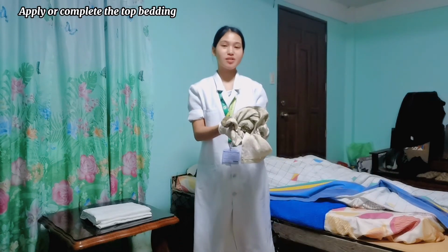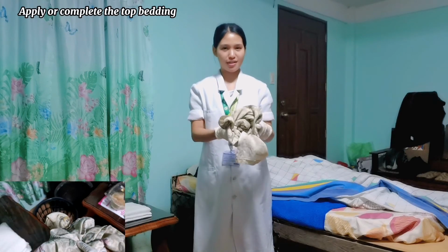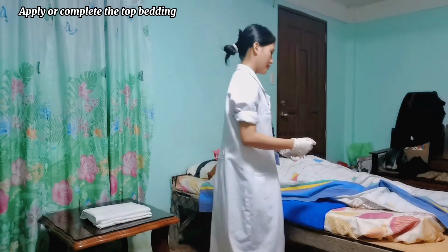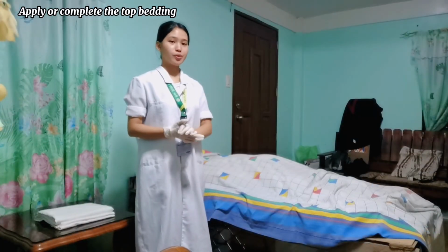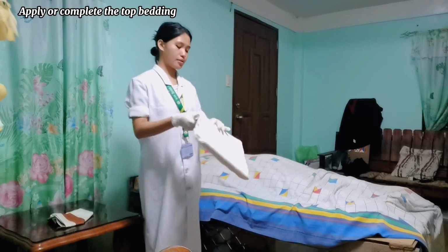And then dispose the bath blanket in a hamper or linen barrel. After that we're going to put a blanket over the patient.